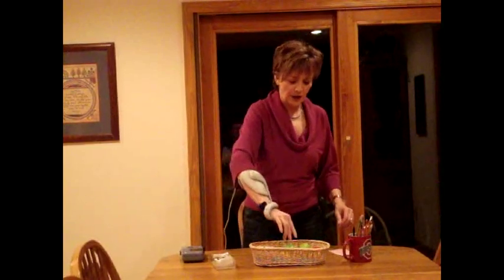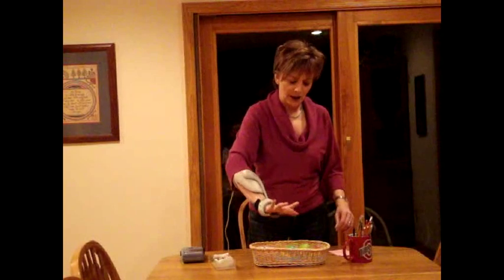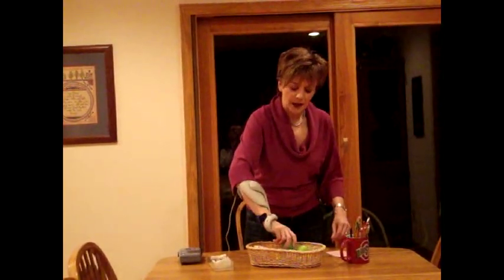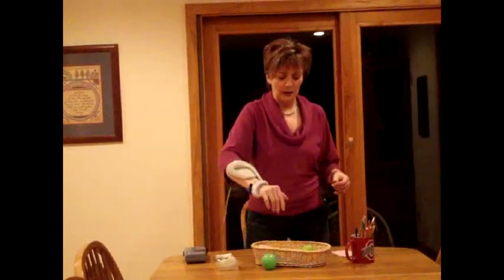So I just got a few things from around the house. This is from the grandkids' toys. And so when it opened my hand, I tried to reach down. I'll wait till it opens my hand up. Okay, it's opening my hand. And then when the stimulation stops, I'm picking up a ball. And then I moved it out, and I would drop it into another container when it opened up my hand, because I couldn't open my hand by myself. So I picked up large objects.